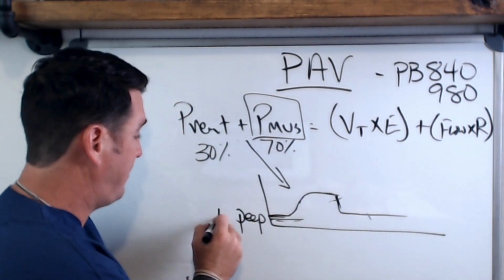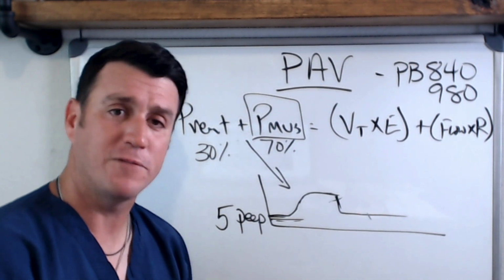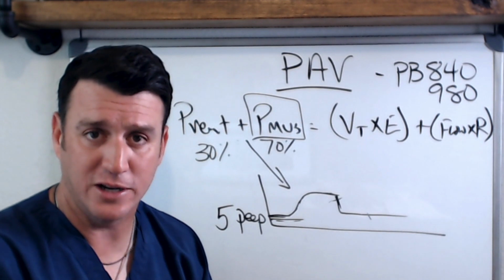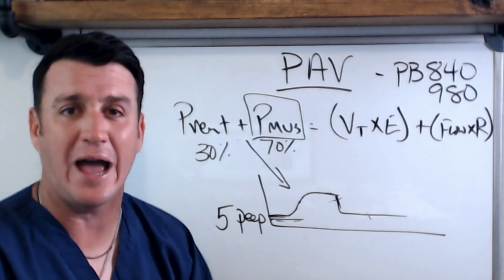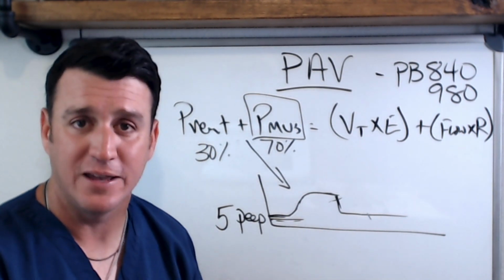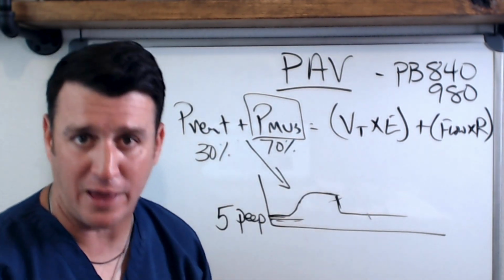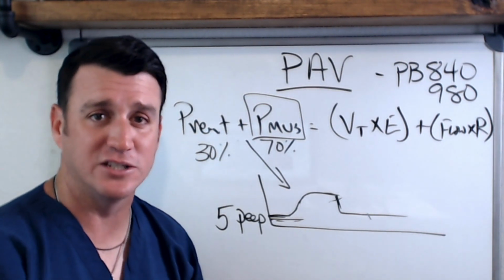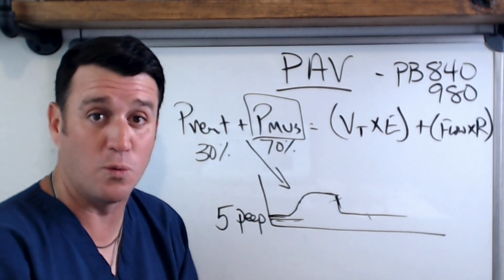What I'm saying is if you're on a PEEP of 5, and you're looking at your vent and you're going, okay, everything looks good. Joe said that if they're in the green zone, then everything is good. But my care team, my physician, my nurse, they're wanting to know how much support is this patient getting. I got an RSBI of 50, and they want to know how much is actually being applied to each breath, okay? How much support? And you say, well, it doesn't work like that because the support is variable in proportion to the patient's workload, to their work of breathing.